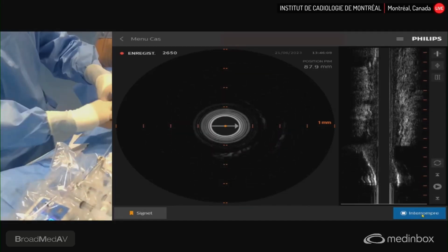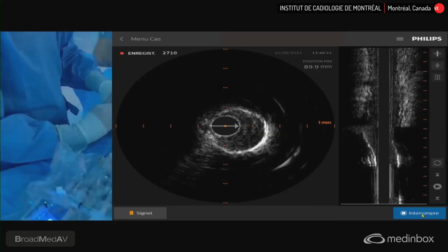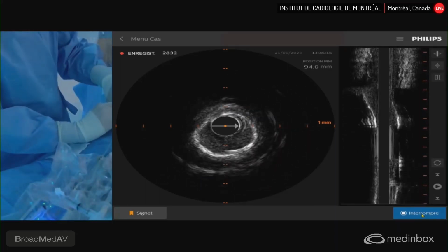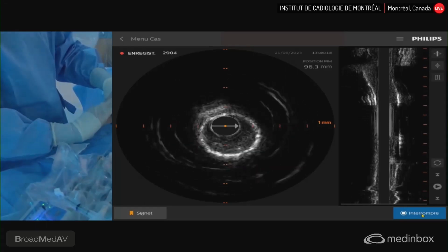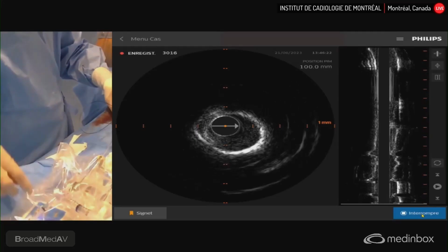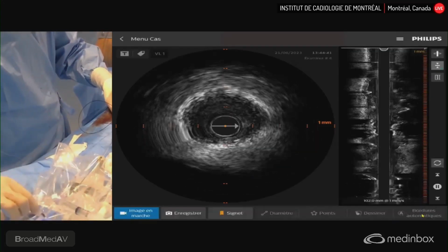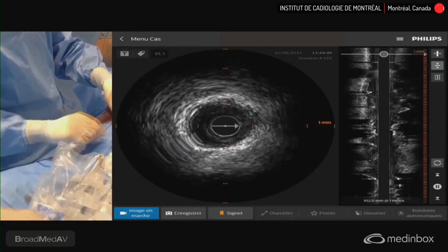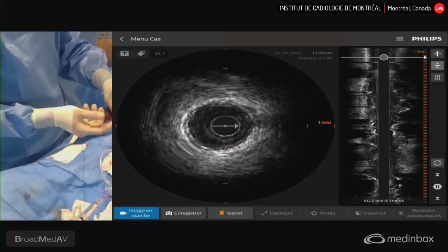Okay, so guiding catheter. So Mohammed, what's your assessment? I don't think we actually need to do plaque modification. No, I don't think so either. I agree. I think right now the length and the extent of calcification does not seem to be enough for us to justify plaque modification. So we think we're going to go through with balloon.